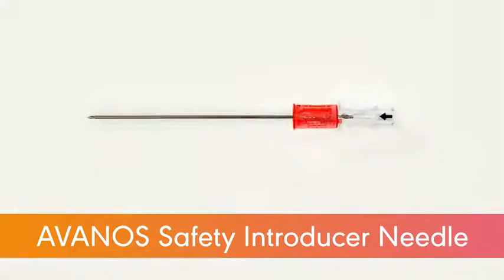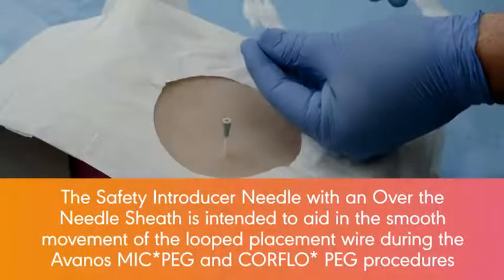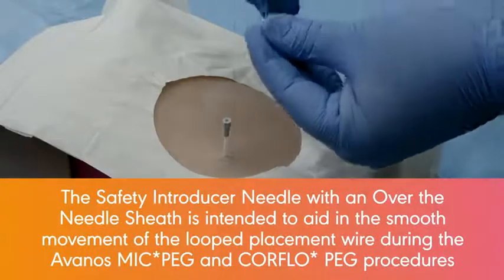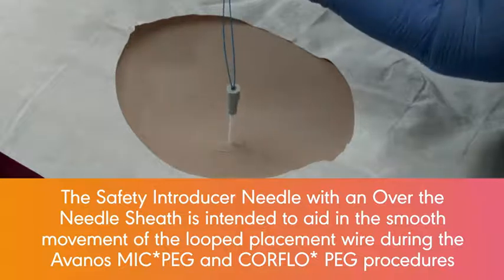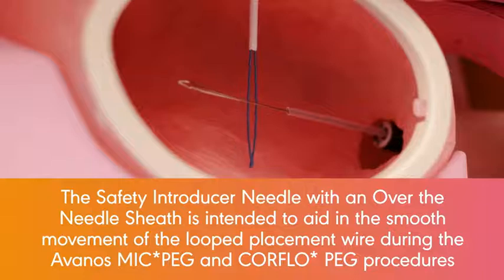This video demonstrates how to use the Avanos Safety Introducer Needle with an over-the-needle sheath. The Safety Introducer Needle with an over-the-needle sheath is intended to aid in the smooth movement of the looped placement wire during the Avanos MIC PEG and CORFLO PEG procedures.